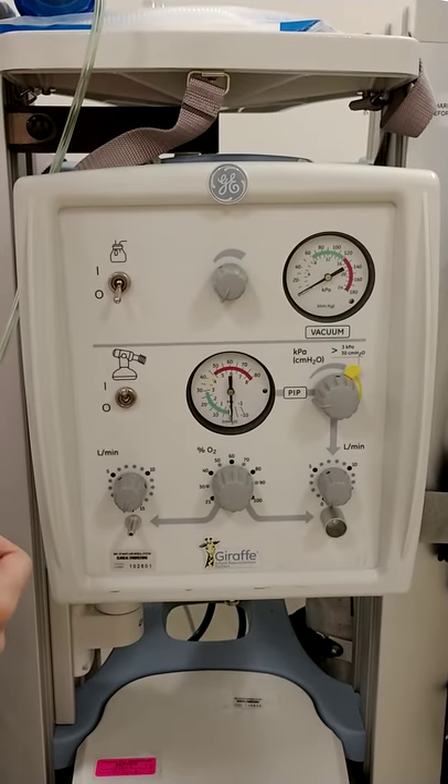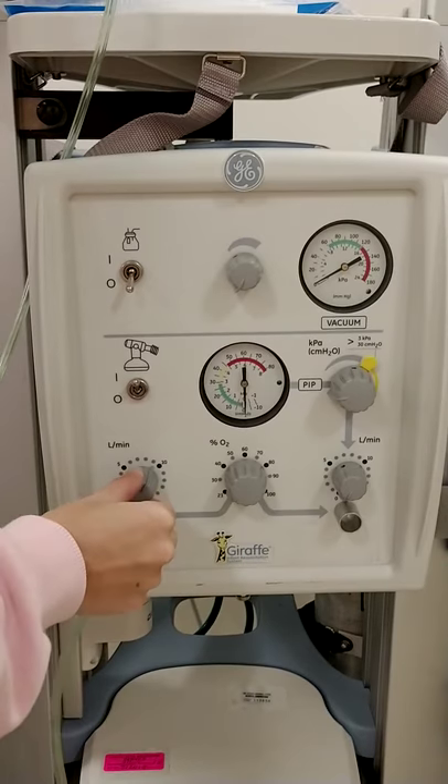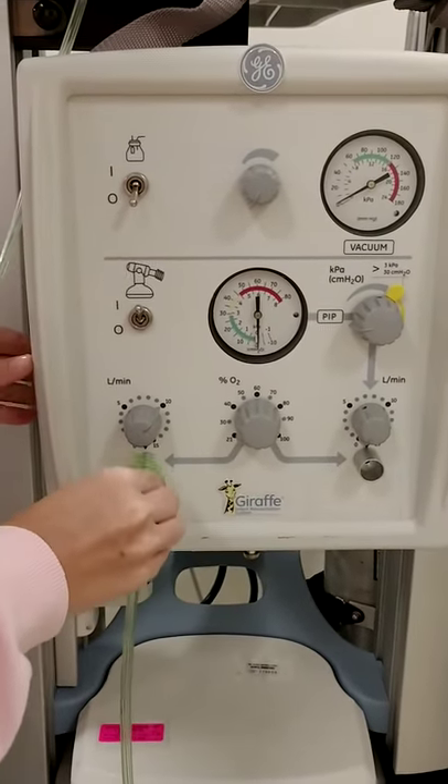The bottom left hand dial is the flow for your bag. You're going to turn that to 10 liters a minute and connect your Ambu bag to the bottom port.